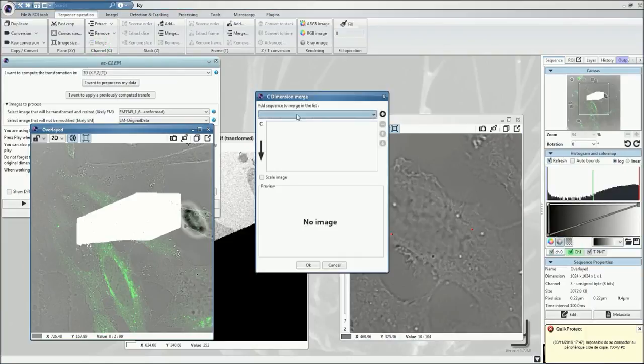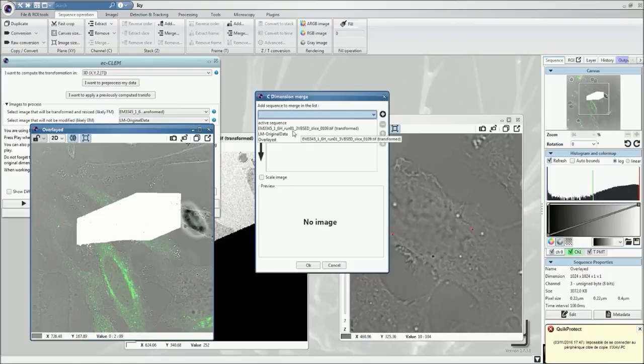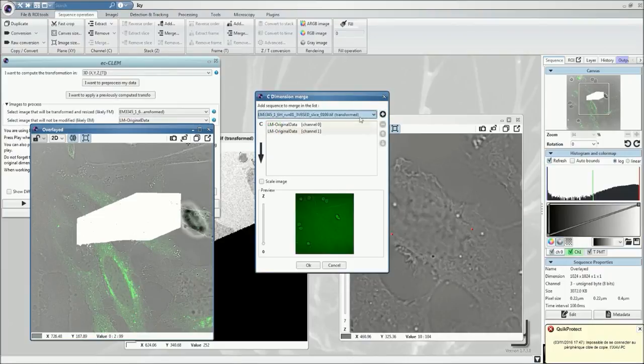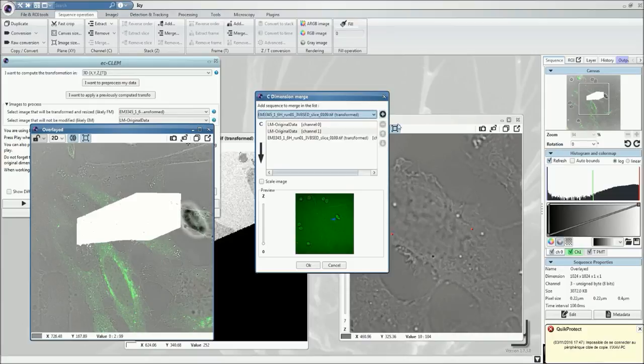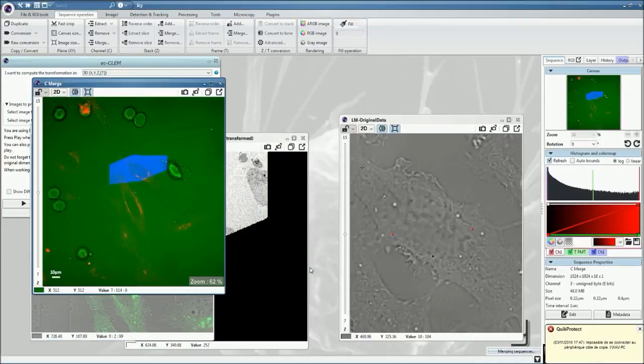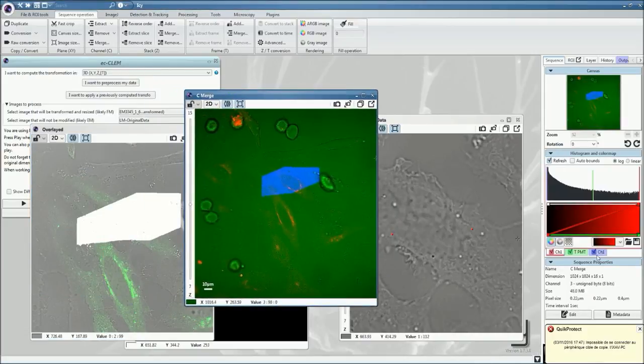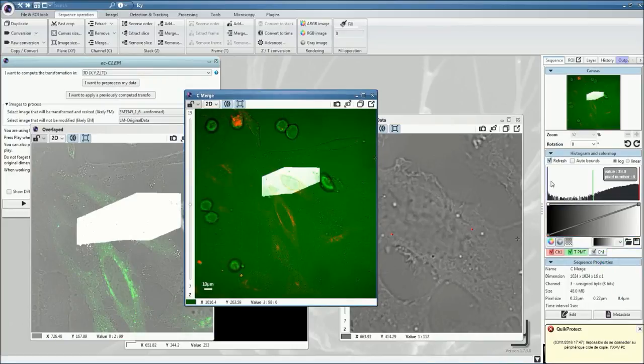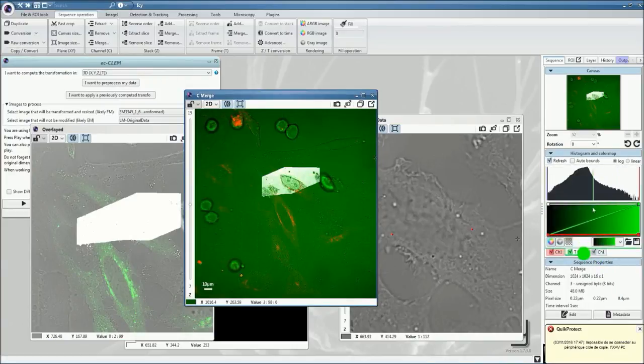Now, if you want to merge both signals together, you go in the two merged channels, take the fluorescence micrograph here, add it, you have two channels displayed, take the electron micrograph, add it, and then create the whole volume.